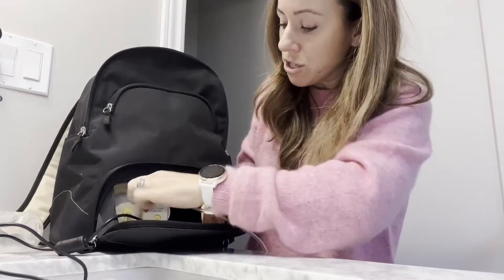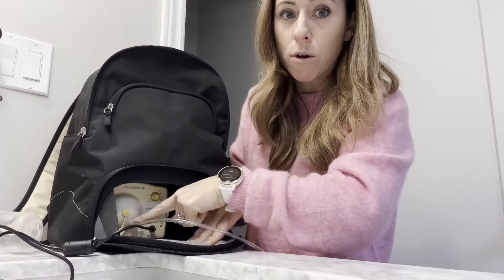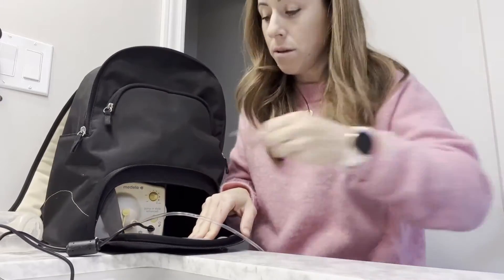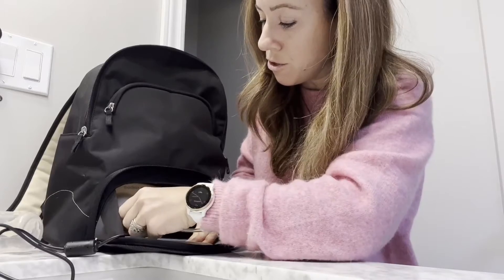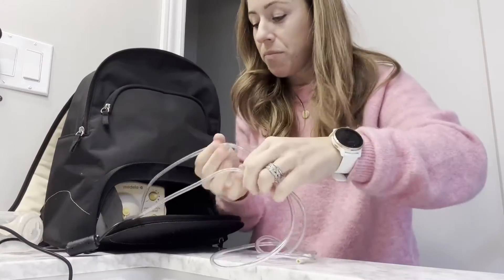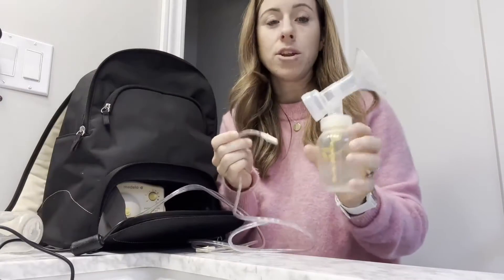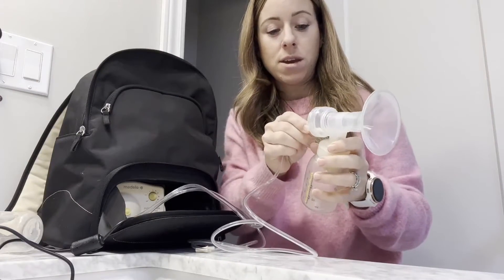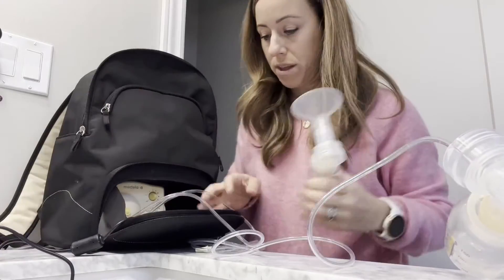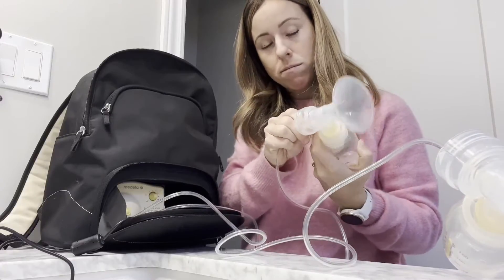With all the wiring, you just stick it in here and push it into the corner. I'm going to grab the second one because sometimes it's easier to do two breasts instead of one. Now I have my two cords — super easy to use — and then you plug it into this. There's one, and I'll go with a second one as well.